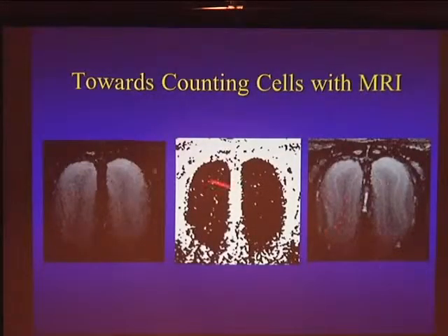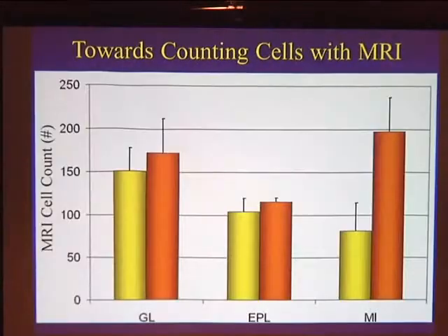And now not only are we counting cells, but because we can do cytoarchitecture with the MR, we can break the olfactory bulb into its layers, the glomerular cell layer, the mitral cell layer and the external plexiform layer. And so the images of the cells, which here I've inverted so they look white, now turned red, can be overlaid on the anatomy so we can put the cells on the right layer in the olfactory bulb, and the animal is still happy and alive.